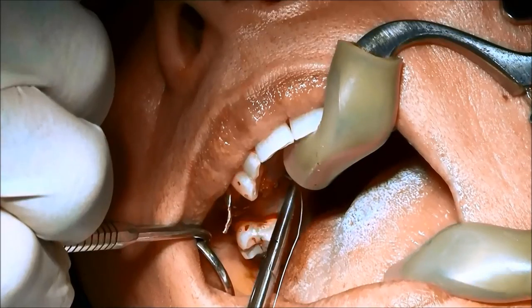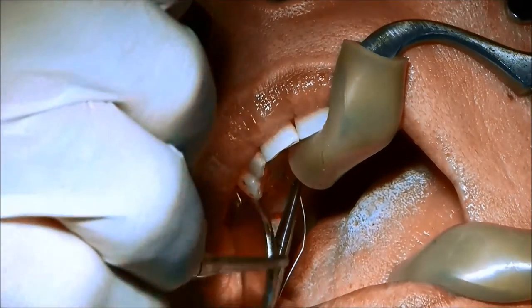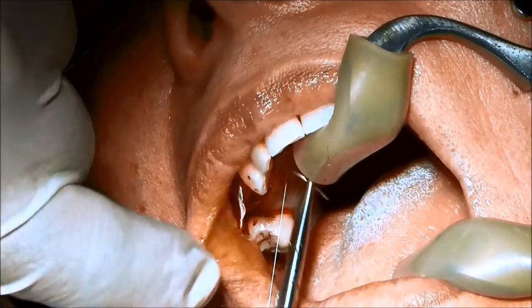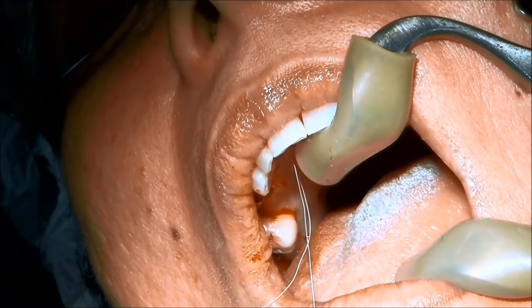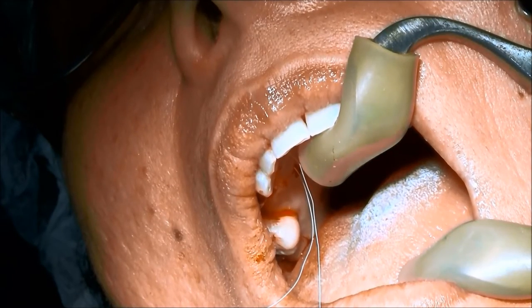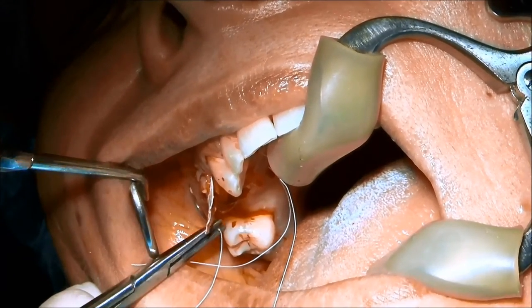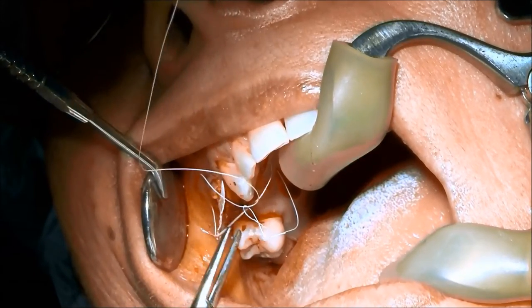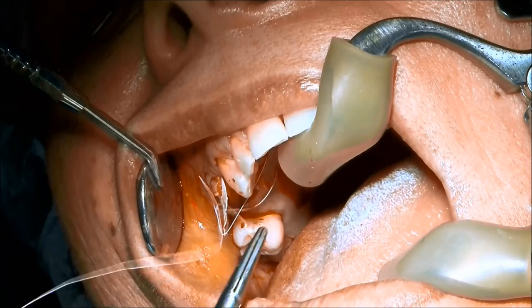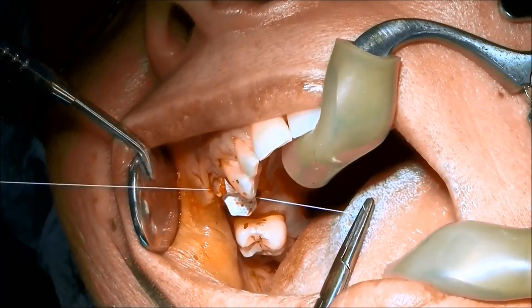Here I'm using the second part — I'm going to use this membrane, fold it, and this is advanced PRF membrane. We're going to use double layers of PRF membrane and also cover it with a non-resorbable membrane, a special membrane that can stay exposed to the oral environment. I'm not going to be pulling this tissue, not going to score the periosteum — I'm more apically positioning the flap instead of coronally positioning the flap in this technique.